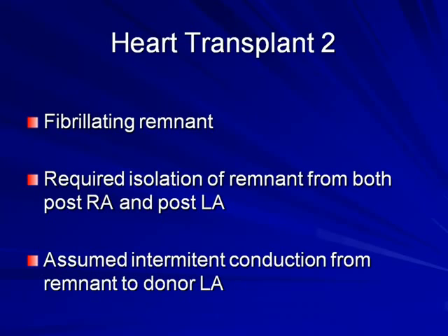So this is a second heart transplant patient to show you, and this is actually a little more common. This is a patient that had fibrillation from the remnant itself. Now, as I said a minute ago, when the remnant is fibrillating, as long as it's electrically isolated from the rest of the heart, you couldn't really do anything.